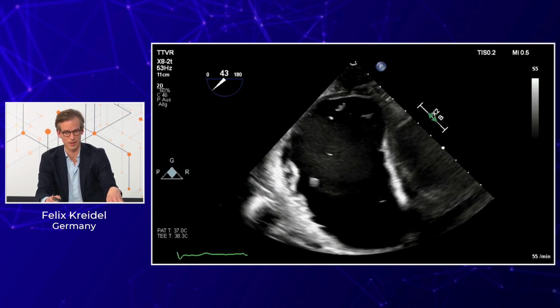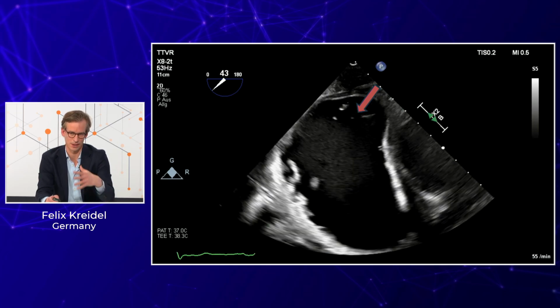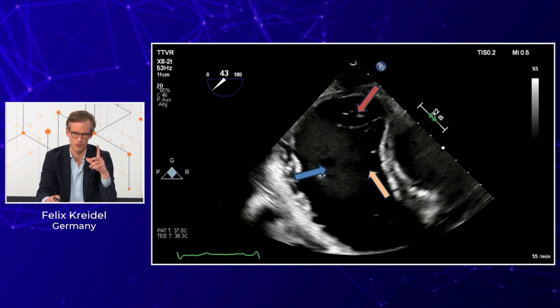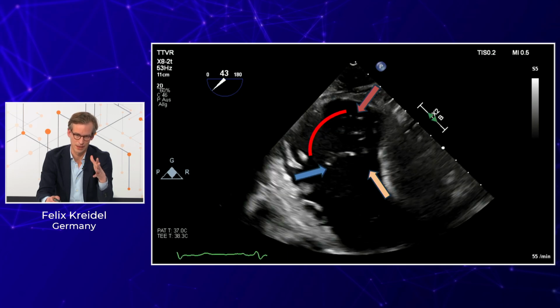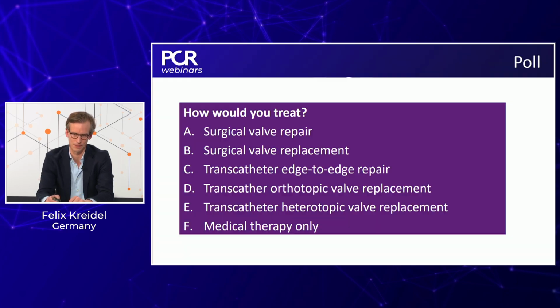When we saw this patient, there were no signs of endocarditis. So again, here, this is transgastric, just to show you how we look at it: posterior septal commissure, anteroseptal commissure, anteroposterior commissure, and in between, the posterior leaflet, which is obviously here. You can't really appreciate that very nice echo-rich leaflet edge.